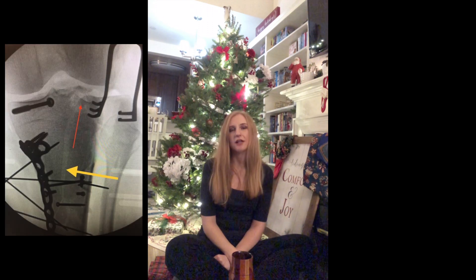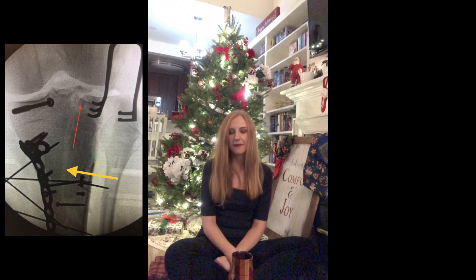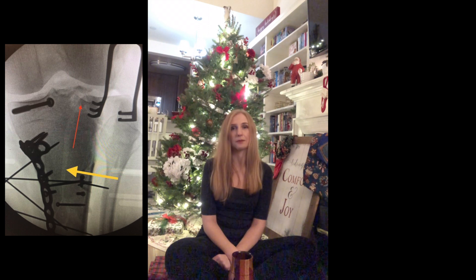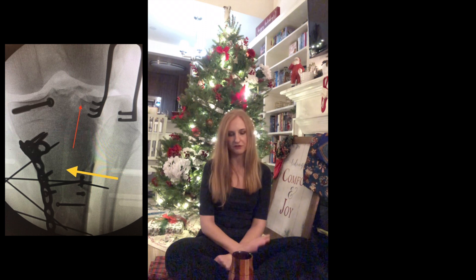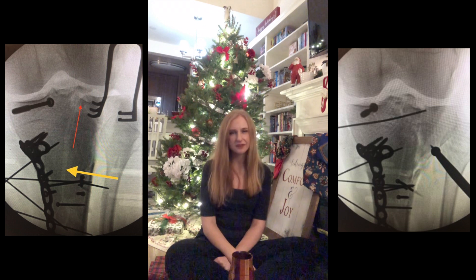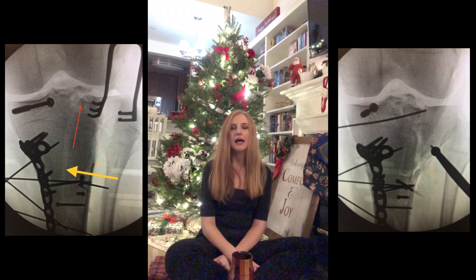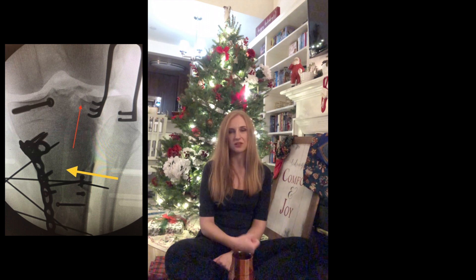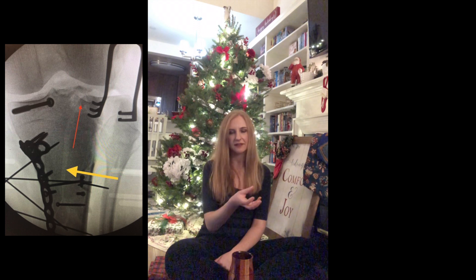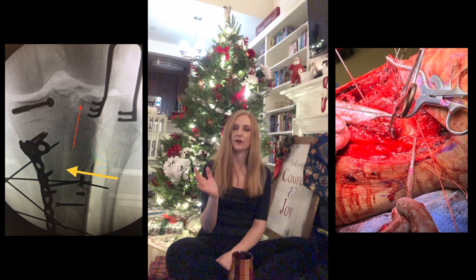In this next fluoroscopy shot, you see the joint labeled in red — that's the piece I'm going after next. I've opened the plateau on the lateral side to go after that piece. The yellow arrow points to the displacement at fragment X, the posterior fragment I mentioned that I wasn't going after directly. After a couple of tries — you can see my K-wire attempt at the joint still not reduced — I used a technique from the OrthoHub plateau webinar: take that depressed fragment, get a read off the most lateral portion of the plateau in an in-out-in approach, take the fragment out, build it to the lateral side, and then build the whole thing back as a unit.